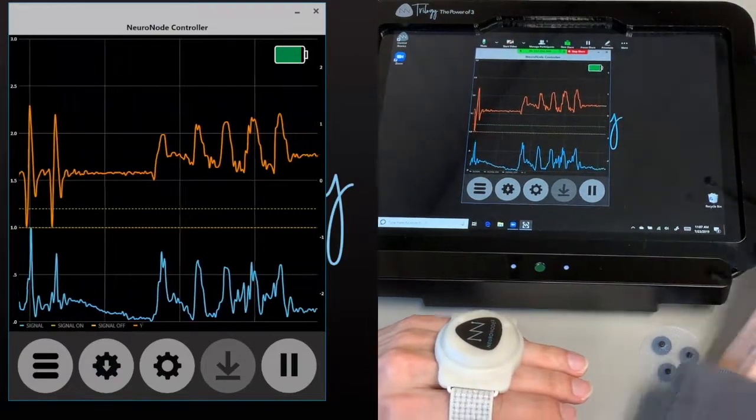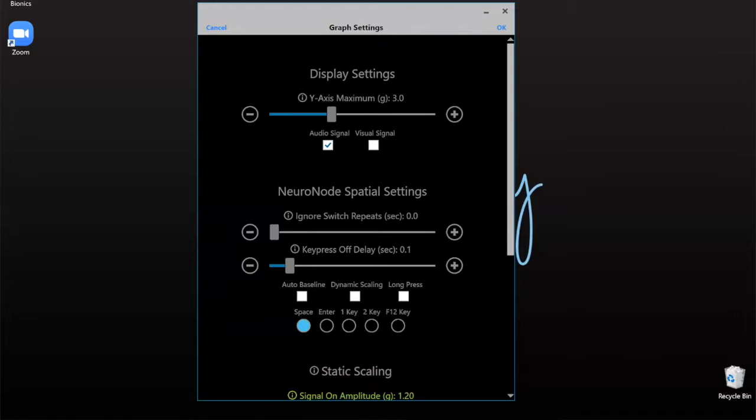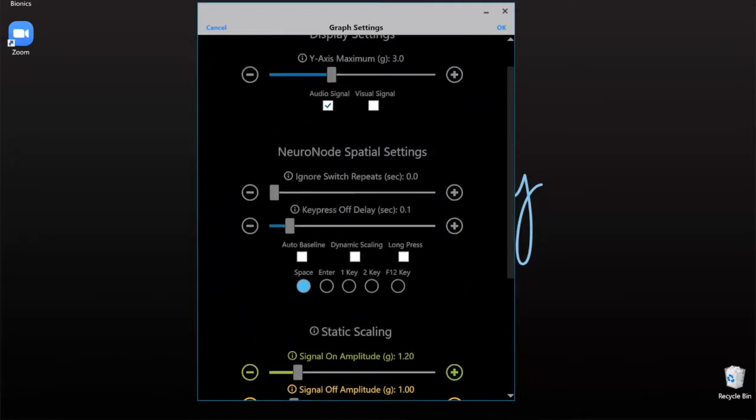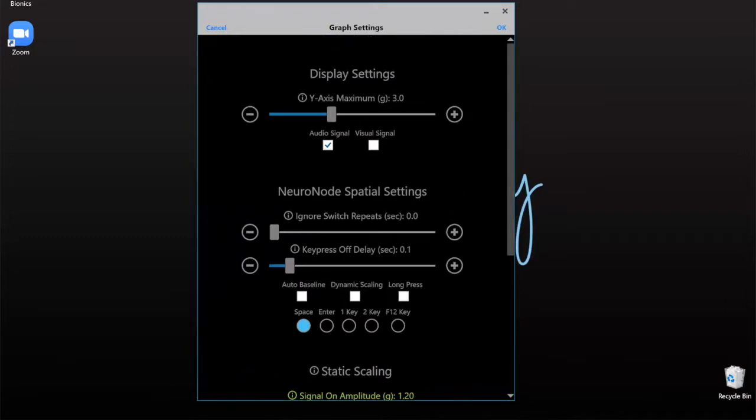So let's go ahead into our middle button down at the bottom, and you'll notice these are going to be very similar settings. You're still going to have your static scaling, your dynamic scaling. All of your spatial settings are here — instead of saying EMG, they're still going to do the same purpose. So this whole section is still going to be the same as EMG. Ignore switch repeats is going to give you a block whenever you make a switch so that you can only switch once in a set period of time.